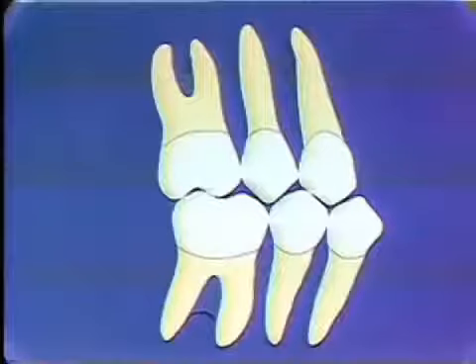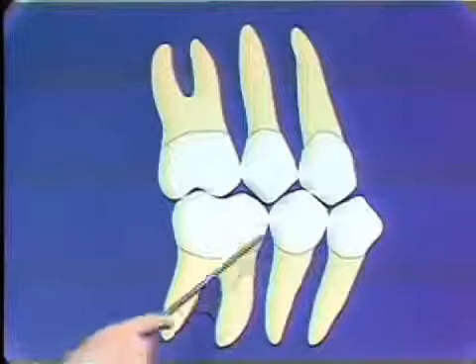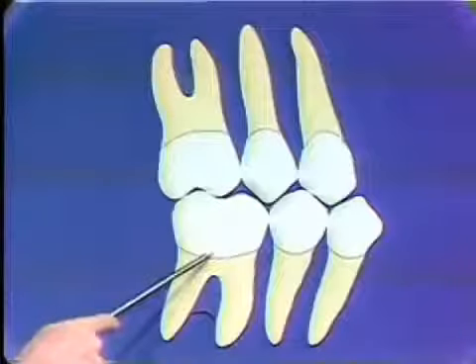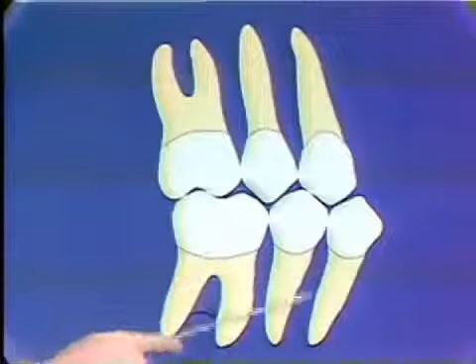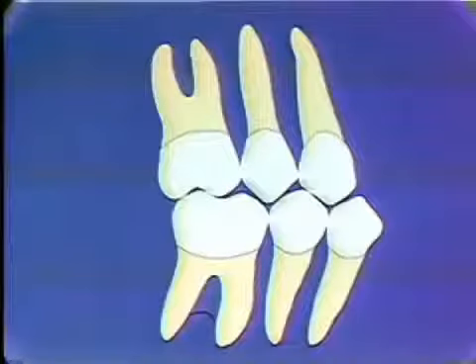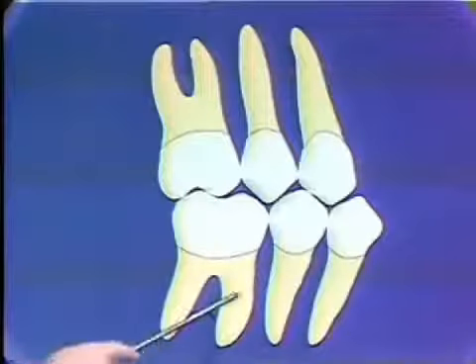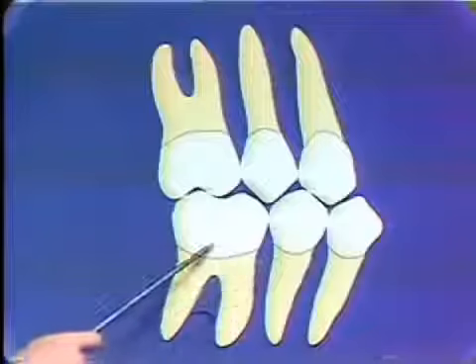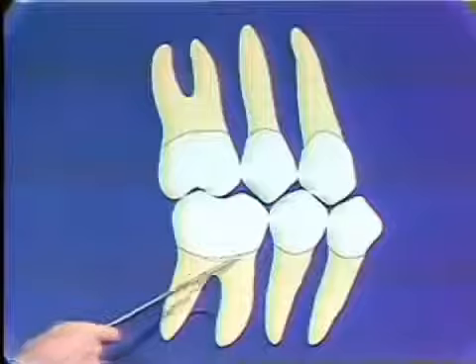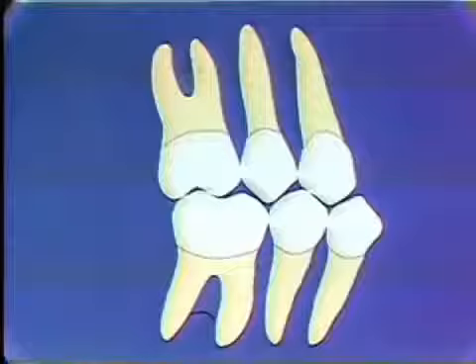It's this anterior component of force, of course, which is responsible for maintaining tight contacts for the mesial drift of the teeth. And also the reason why this molar would tilt forward if this tooth were extracted here. So with that recognition of the types of movement that take place in the teeth, let's see what happens if this tooth was missing and we placed a retainer on this one and put a fixed bridge between these two teeth here. We would lock together two teeth which had been previously able to move independently.